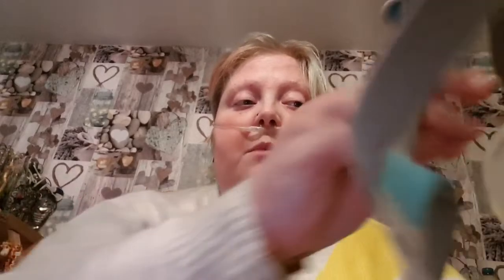This is the AirFit F20, and basically what this one has is interchangeable masks. So for instance, this one, all it does is clip in there, and these bits are magnetic, and this has always been a lot easier for me because of my muscles and because of my sleep paralysis and dissociations. When I'm coming around from them, I need to get my mask off quick, and for Soph, she needs to get it off whilst I'm obviously still sat there breathing on it. This one again loops over your head and just connects around like normal.